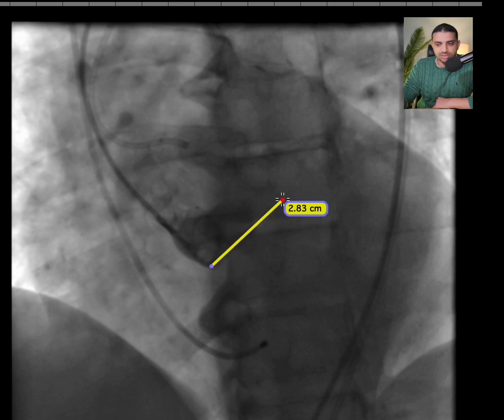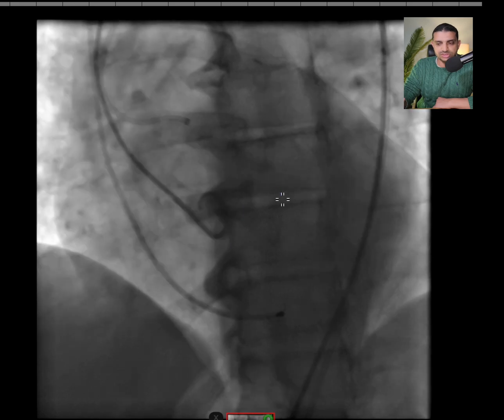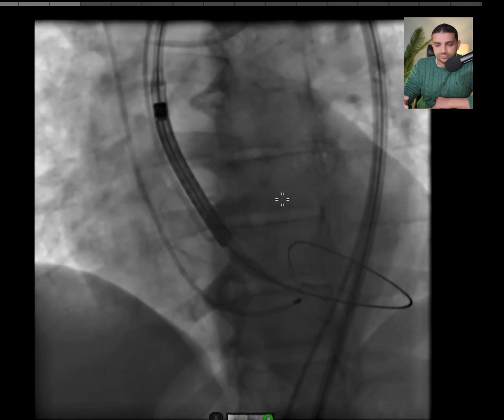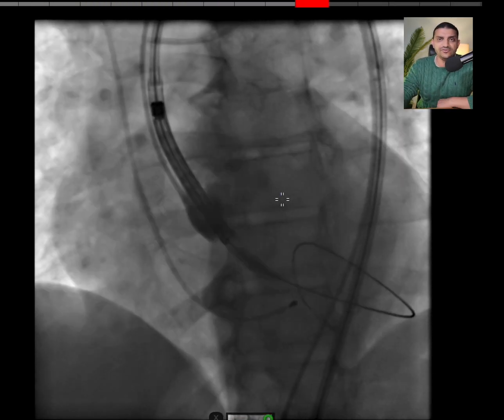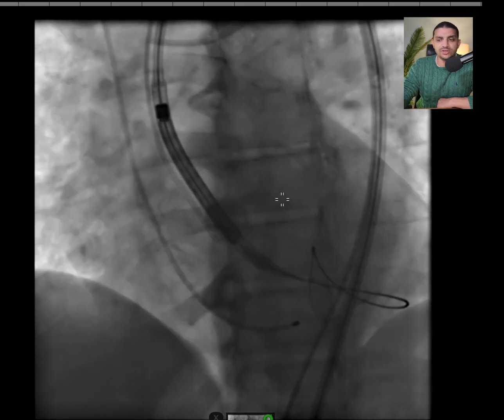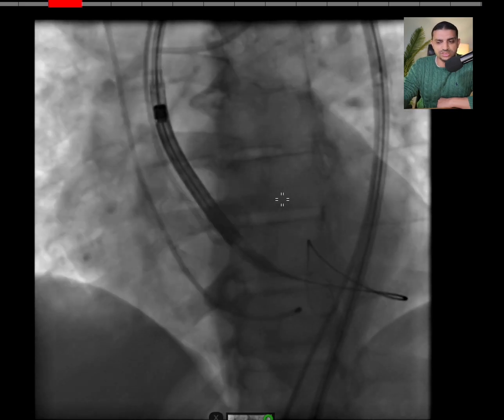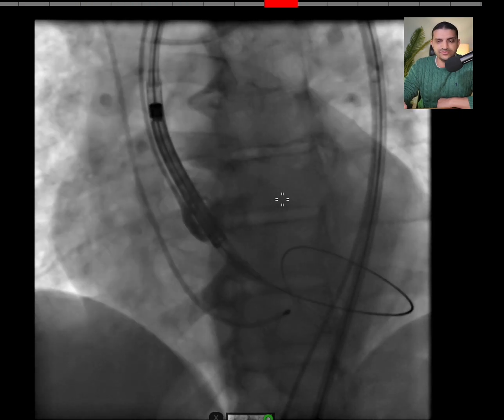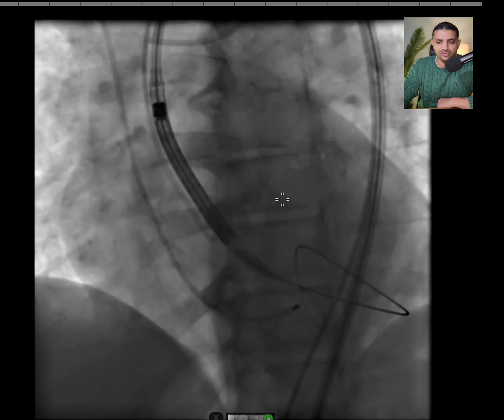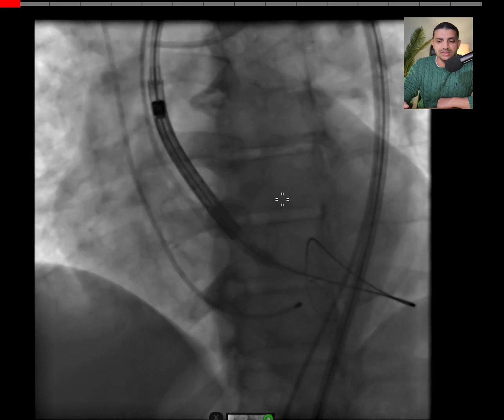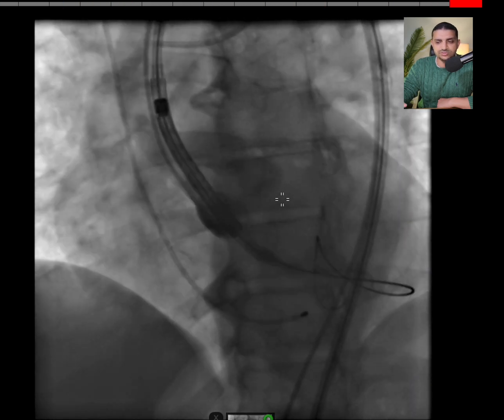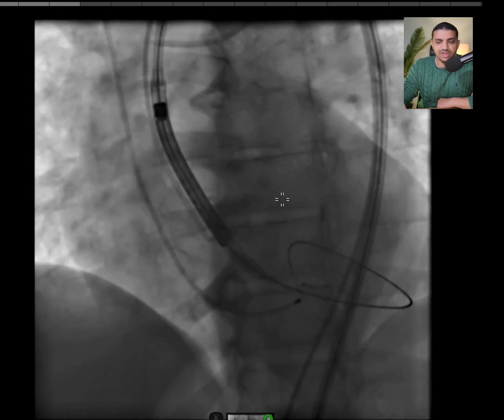Once you're done, start the crossing. Place your stiff wire after making the manual curving of the stiff wire — I'll post a video on how to do a manual curve for the wire. Then after you do this, you start introducing your valve.